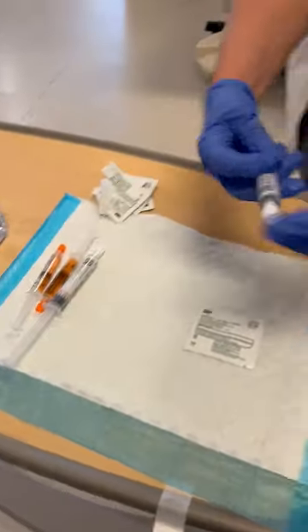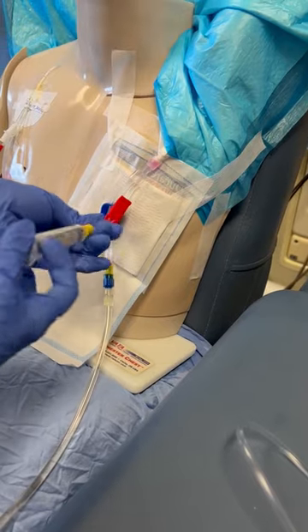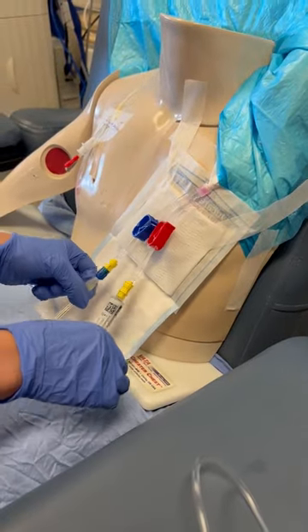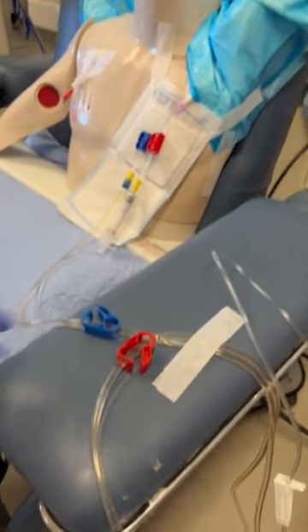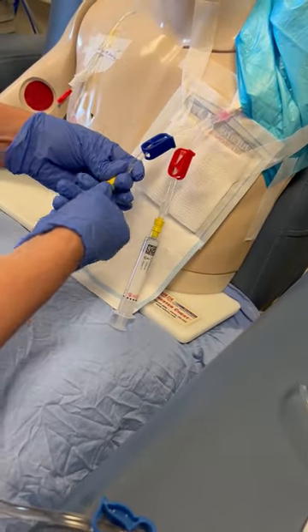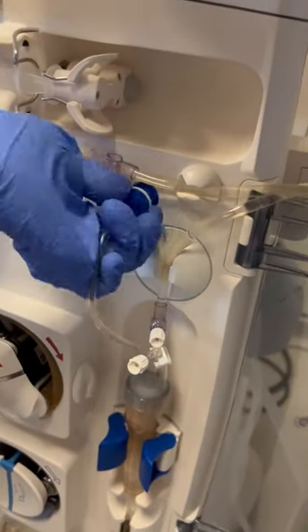Grab a 10 ml saline syringe, removing air bubbles, then clamp and flush turbulently. Since our blood pressure was stable, we can go ahead and remove our venous bloodlines — clamping the two blue clamps, disconnecting the bloodline, then coming over to attach the venous bloodline to our transducer.